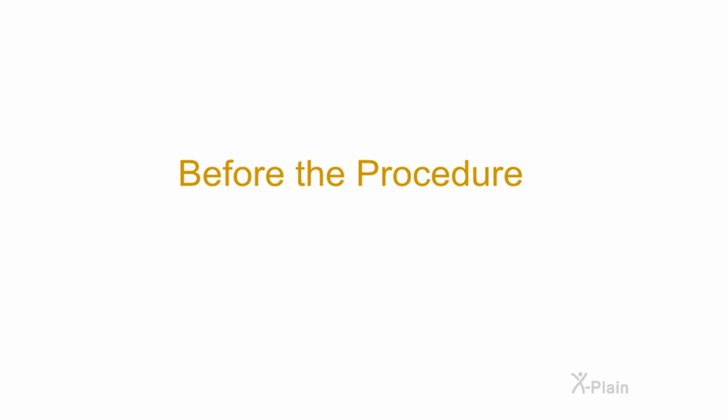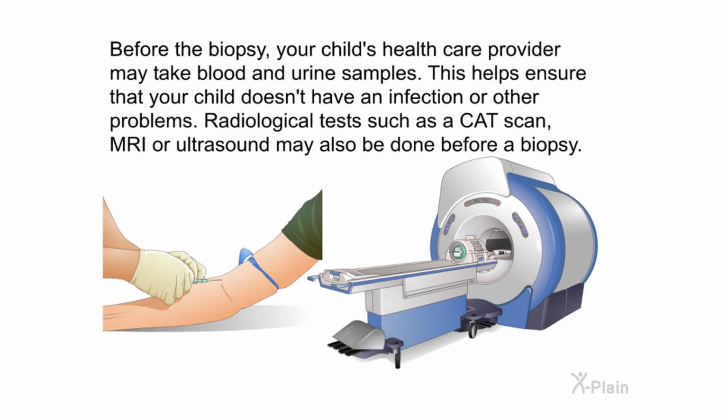Before the procedure. Before the biopsy, your child's healthcare provider may take blood and urine samples. This helps ensure that your child doesn't have an infection or other problems. Radiological tests such as CAT scan, MRI, or ultrasound may also be done before a biopsy.